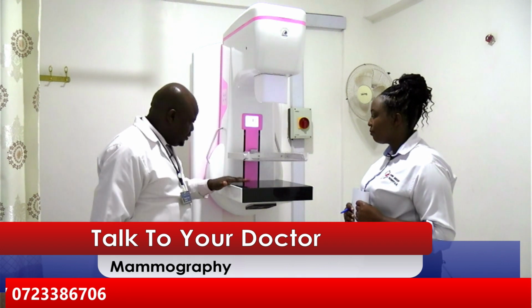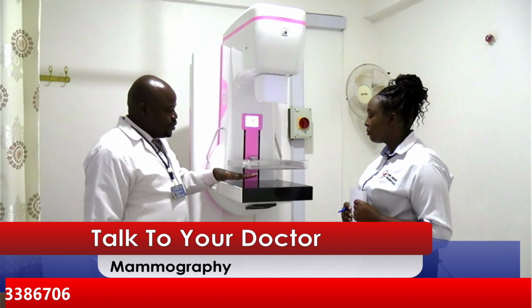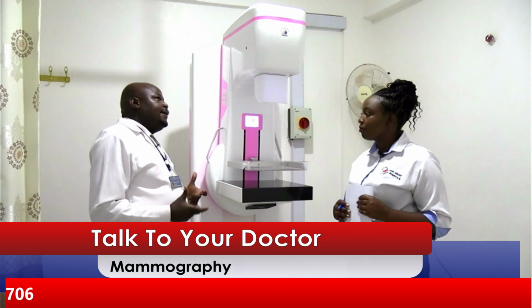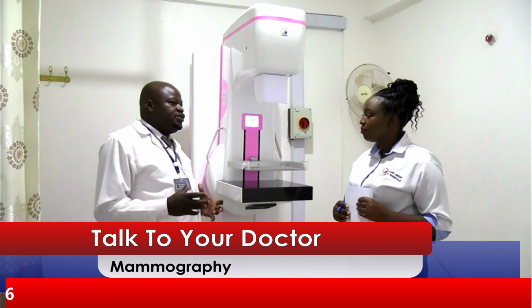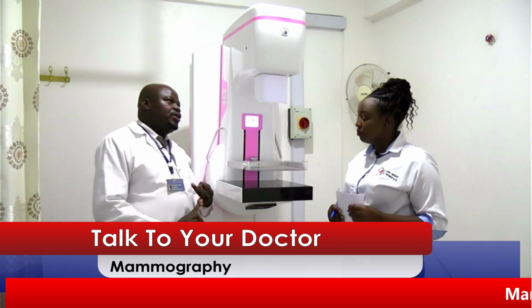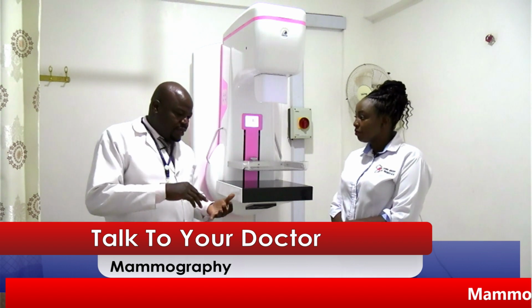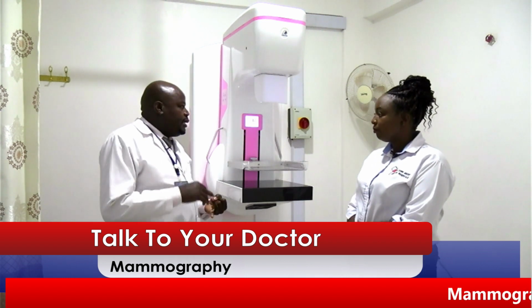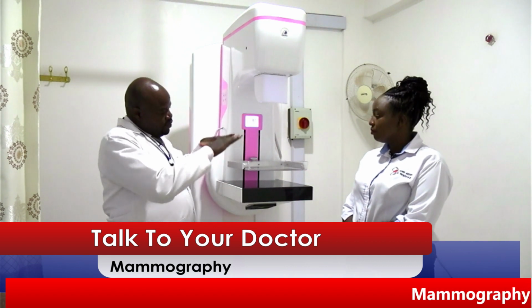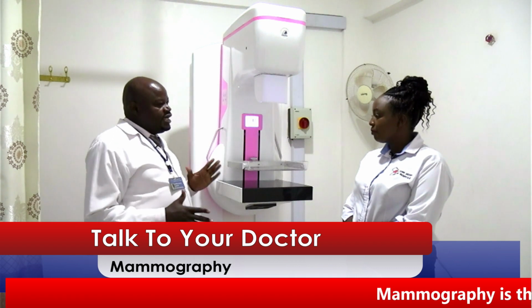You can use these buttons here. You can see it is compressing. So once it is compressed, now you start operating. We usually take the basic views during the procedure. We take 2 basic views. One we call the craniocaudal view. The other one we call lateral or mediolateral oblique. When the machine is at 0 position, you are taking the craniocaudal view.